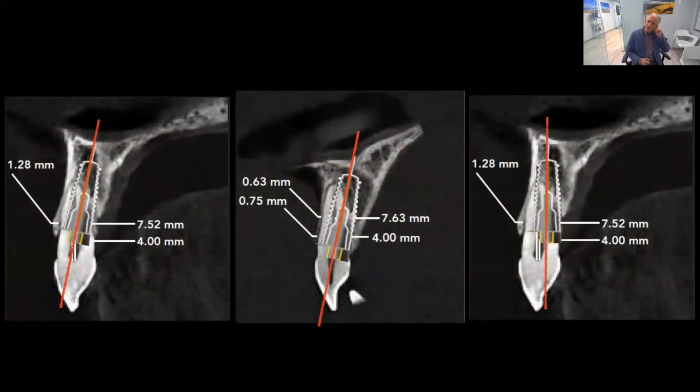And if I look at the early implants that I restored, most of those, if not all the implants really, were done without a cone beam and without guided surgery. If we look at the long axis of the tooth, as opposed to really where the bone was, most of the surgeons were placing the implants where there was bone. And me and maybe most of you, I had a lot of screw access that was coming out facially inclined. And I think that's one of the reasons why I had so much recession, is those implants were just placed without really knowing where that buccal bone was.